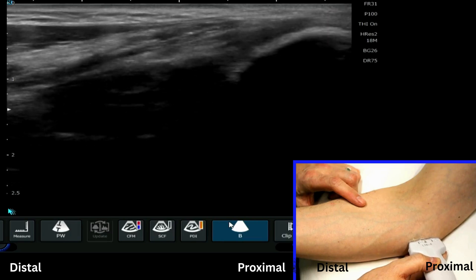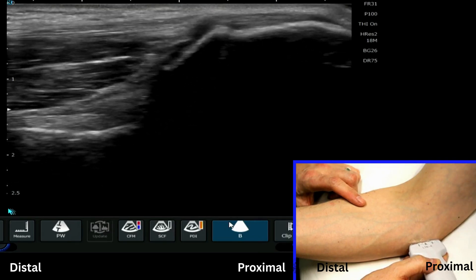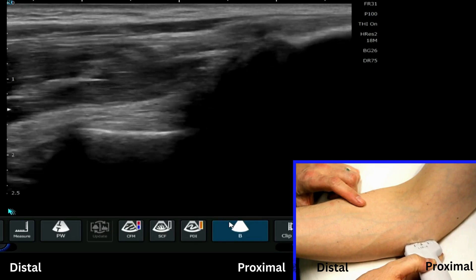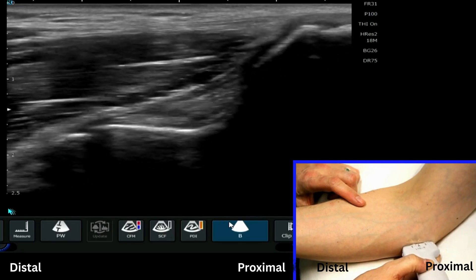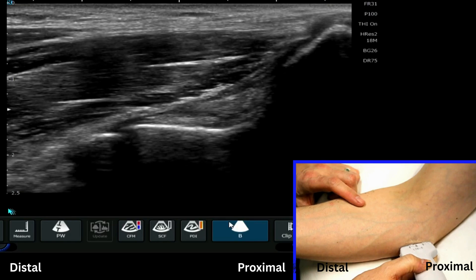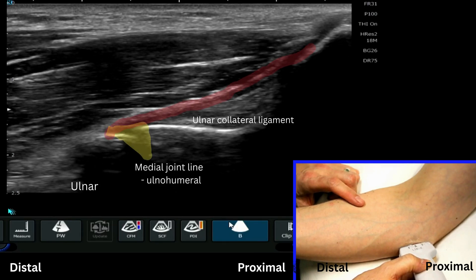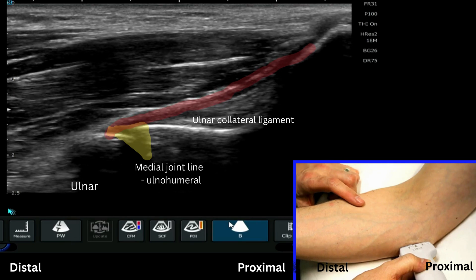If we come back to our starting position, we can look at the elbow joint. I'm just going to move the elbow joint line into the middle of the screen, and in this position we can also look really nicely at the ulnar collateral ligament.